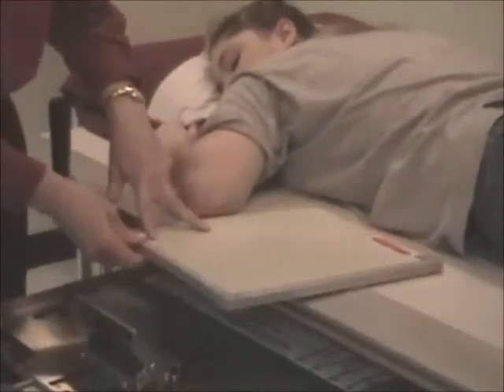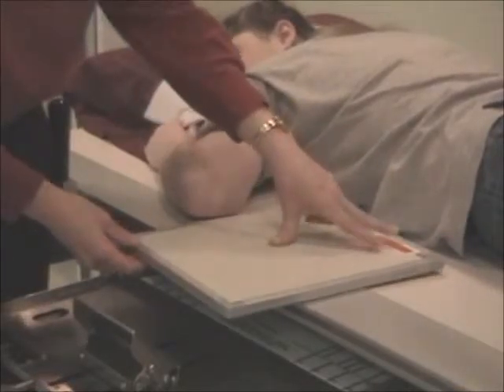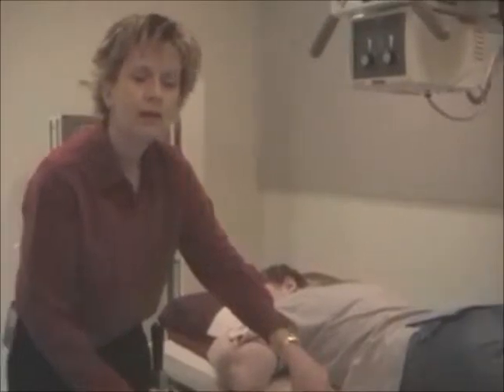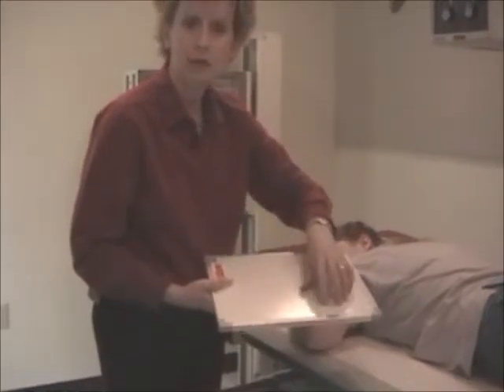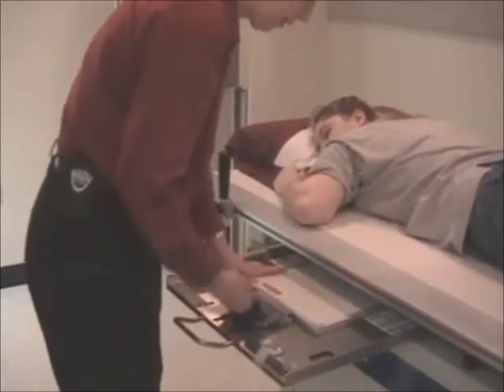So if we reverse the cassette, here's the fundus, circles around to the body, comes over to the pylorus, and now the ID blocker might be into the pyloric region. So you're kind of in trouble perhaps either way. Well, if you were to recognize the fact that say 80% of pathological conditions happen in the pyloric region, that's the area you want to protect. You want to put the ID blocker towards the fundus then. You want to keep the pyloric region free of possible obstacles. That's our rationale for putting the ID blocker towards you as the technologist.